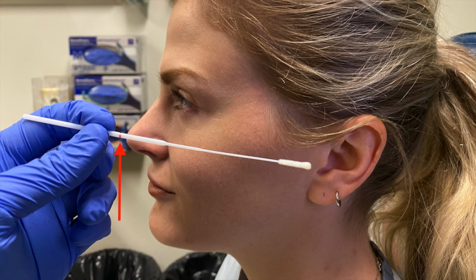It is important to note that at the proper depth of swab placement, the red mark on the swab aligns approximately with the tip of the nose. Be sure not to touch past the point on the swab where the red mark lies, as this could risk contamination of the sample.